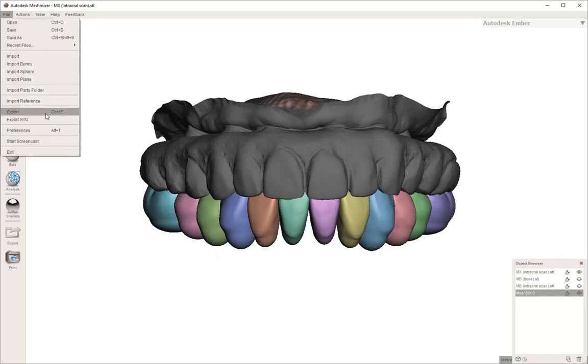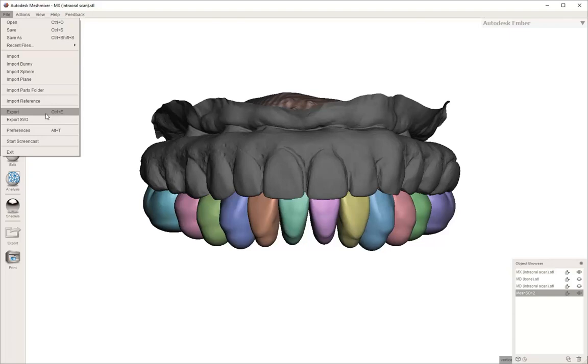Once you get them where you want them to be, essentially now where we're at is we know where we're planning the teeth to be in the final prosthesis or in this interim prosthesis. So we're going to export those teeth as one single STL file.